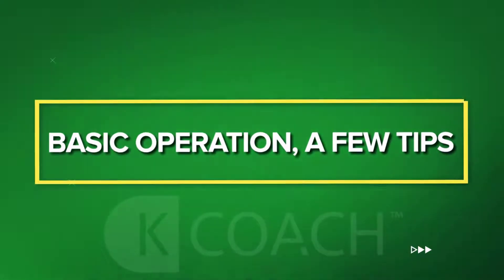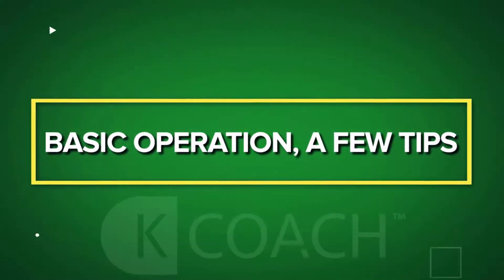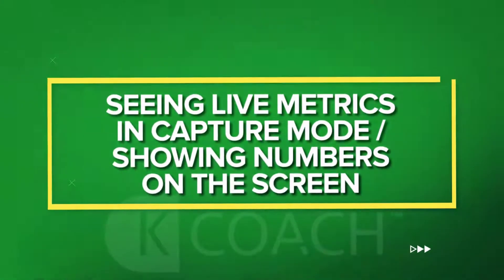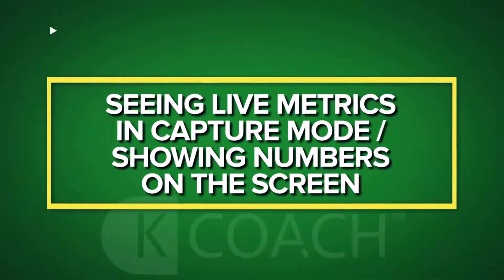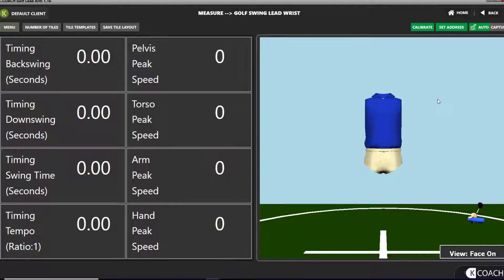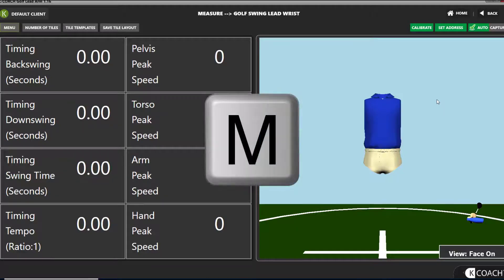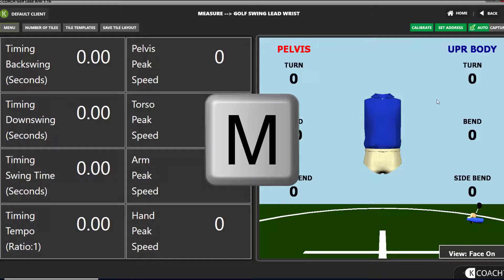Basic operation — a few tips. To see live numbers for the 3D data on your screen when you're in capture mode, press the M key on your computer keyboard.